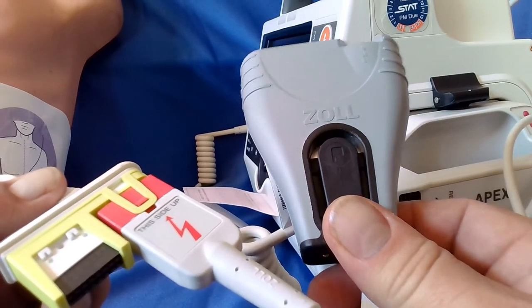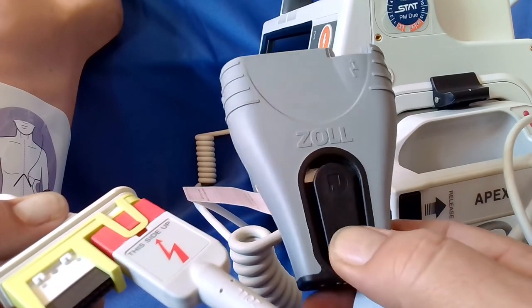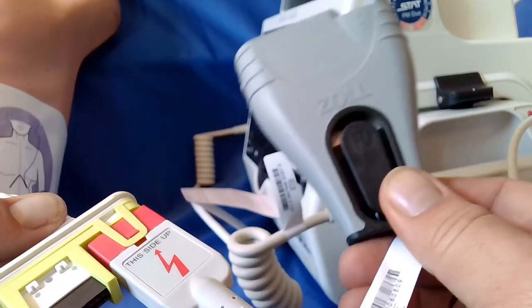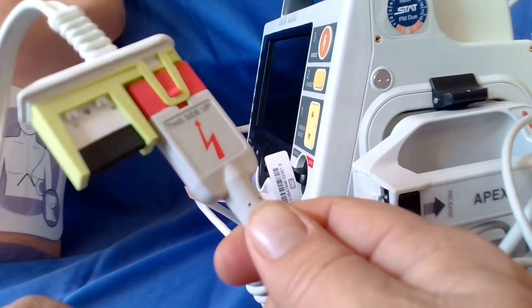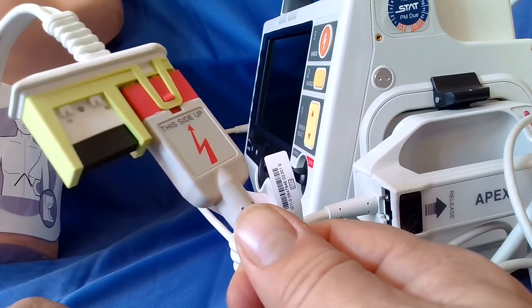you would have seen when we did defibrillation, how we measured our rate and our depth. It was this little device. But if this for some reason gets lost, you are still able to use the device and the pads, and that is how you set up your pads for your patient.